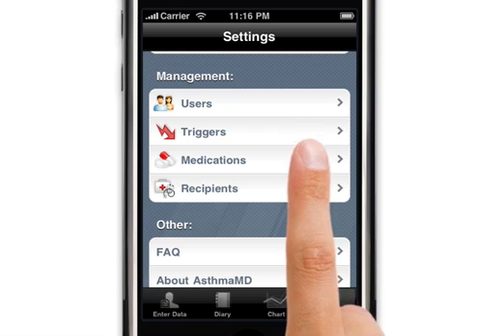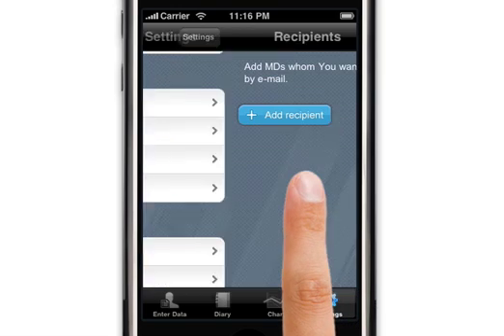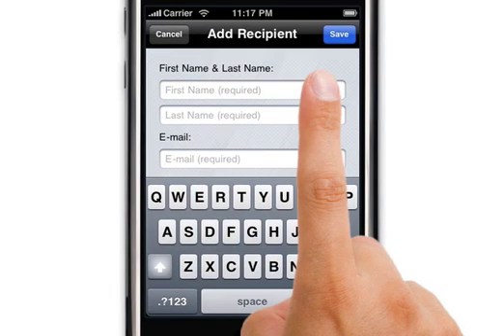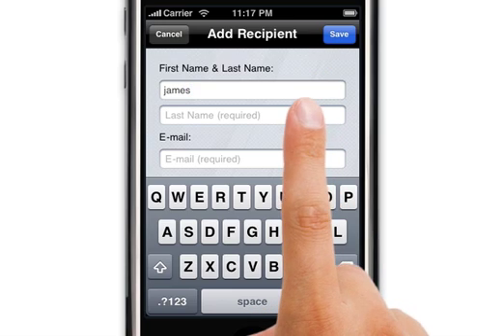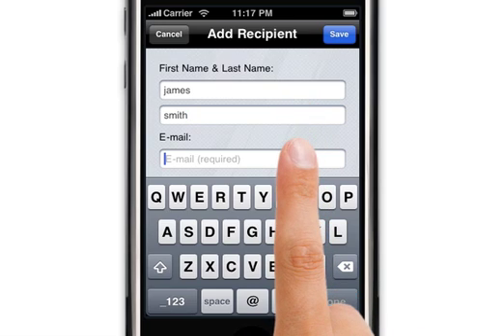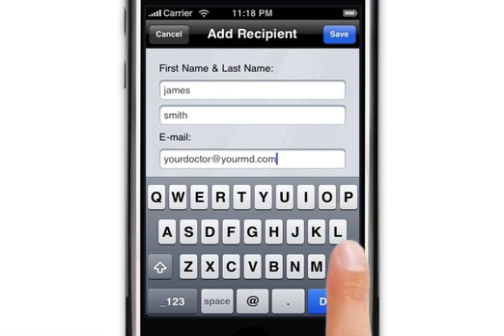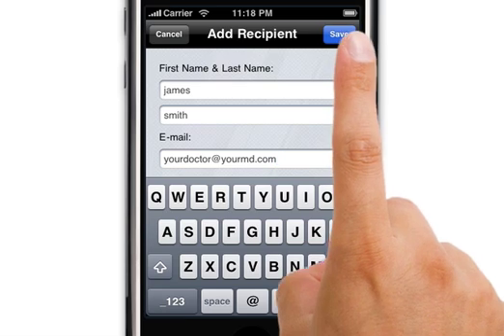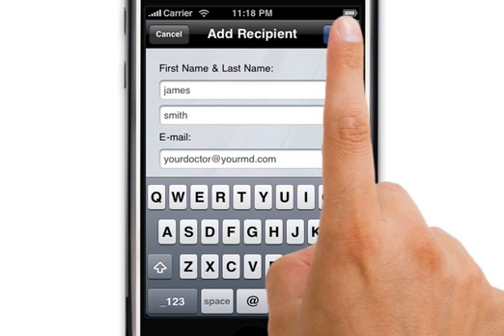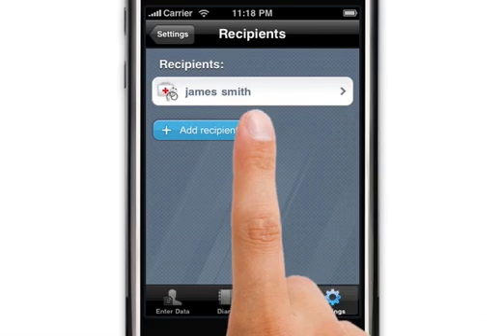Next, we add the recipients of the graph or the diary, because these are the physicians and specialists that you are planning to send your data to when you decide to do so. Please make sure their email addresses are correct prior to sending them the information. Enter your doctor's first name, last name, and email address. Press Done and then Save. After doing so, the recipient's name will appear on the list.